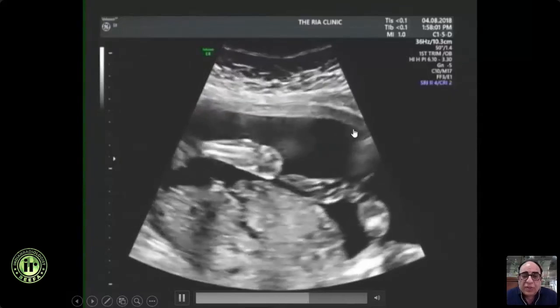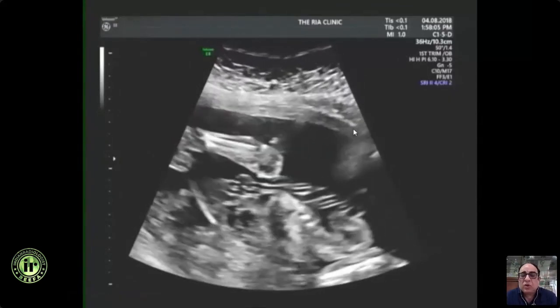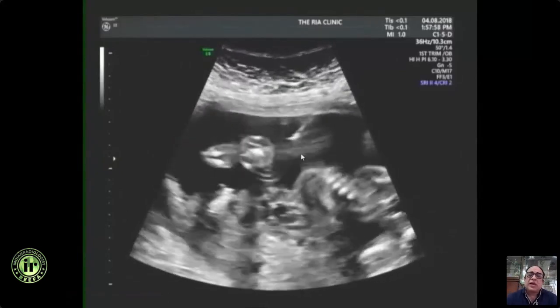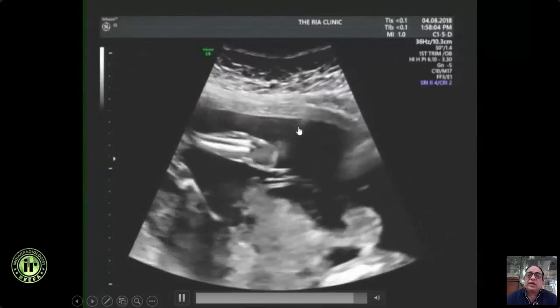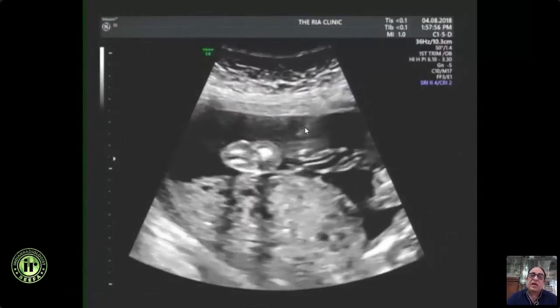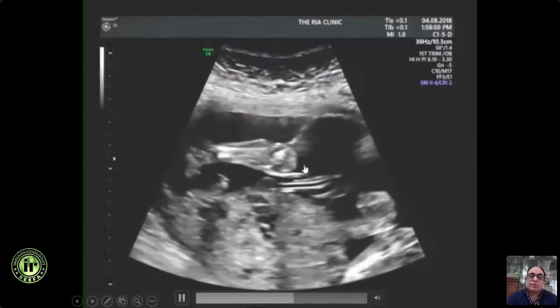It should be at an oblique angle of about 45 degrees, and the procedure should be over in about 20 to 30 seconds. So it should be very rapid. At other times, if you jerk at this side, you may take the amniotic membrane along with you, and you may cause an amniotic separation, and the patient may have a leak. But if it's a very rapid puncture, then this is less likely to happen.